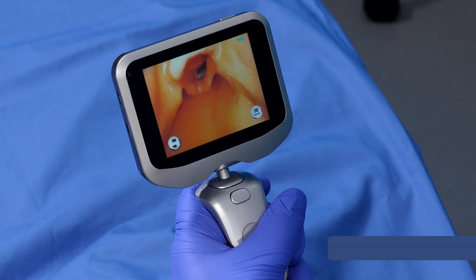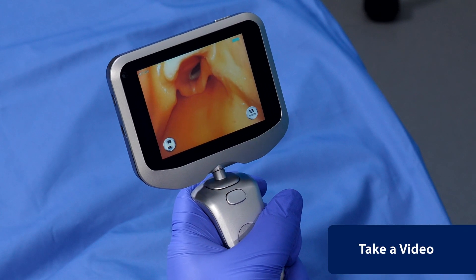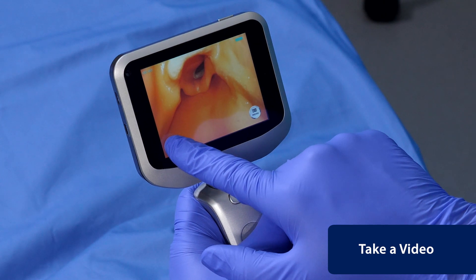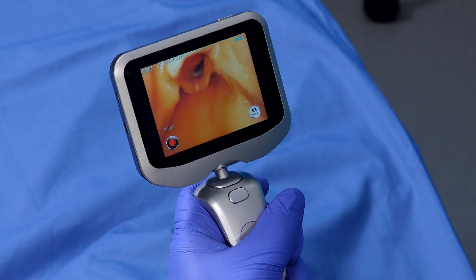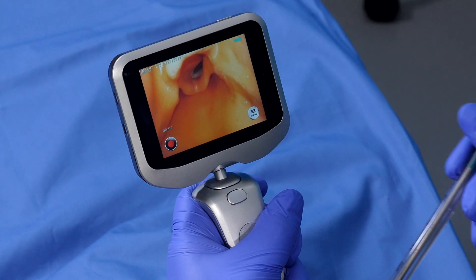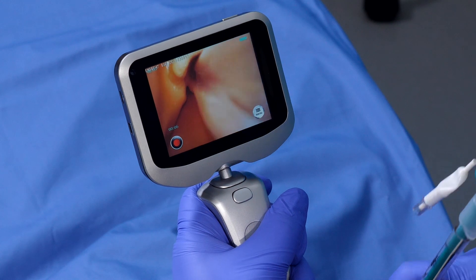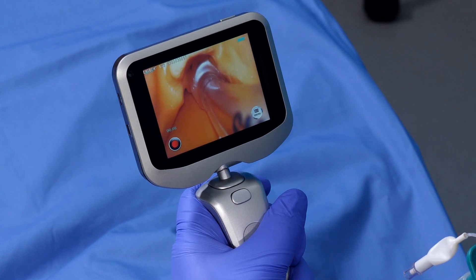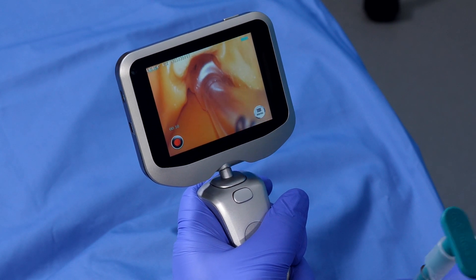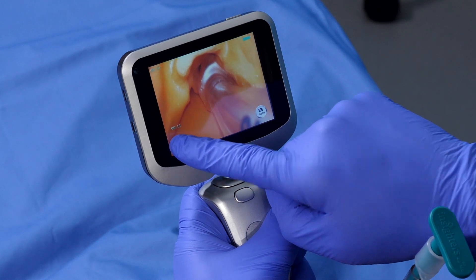To take a video, hold the Photo Video button on the screen for 2-3 seconds. You will hear a confirmatory sound and the recording time will begin. Hold the button to stop recording.